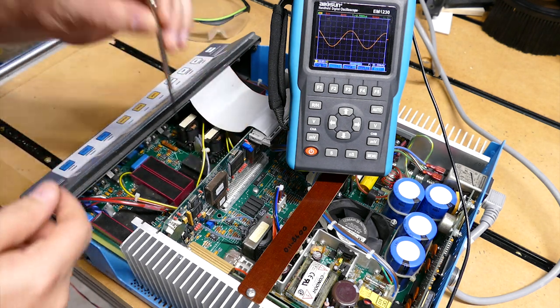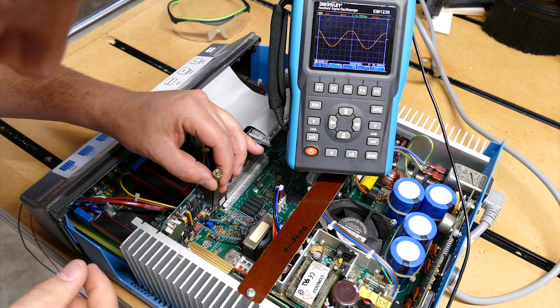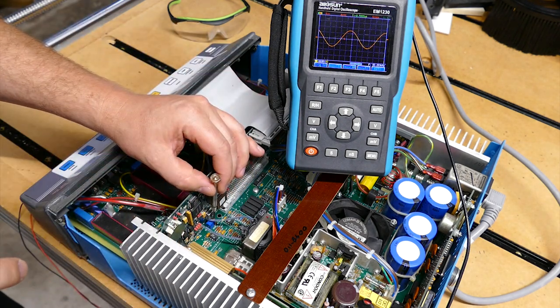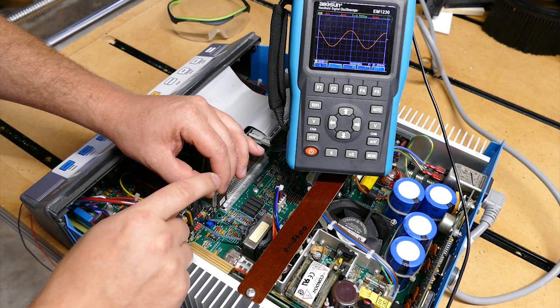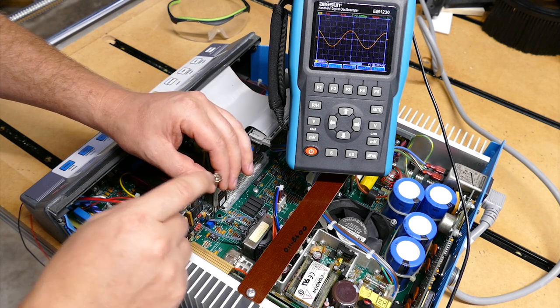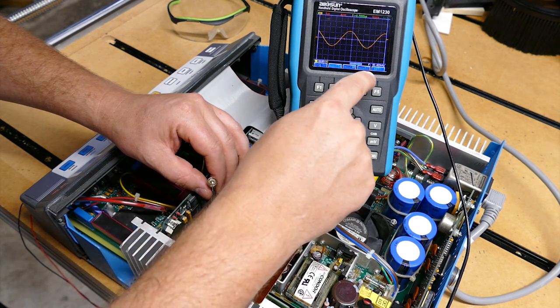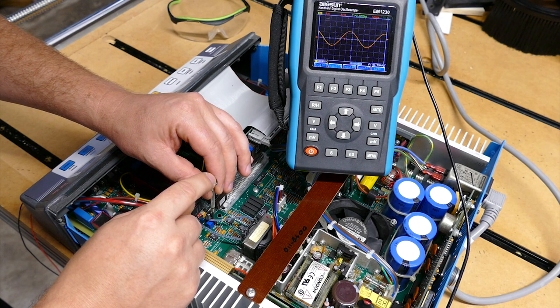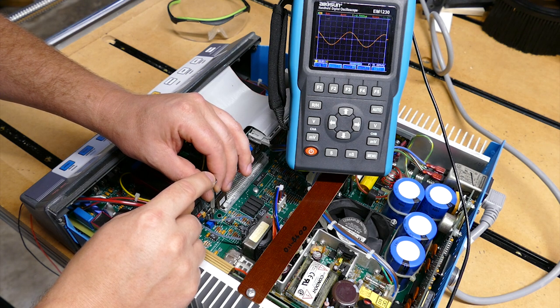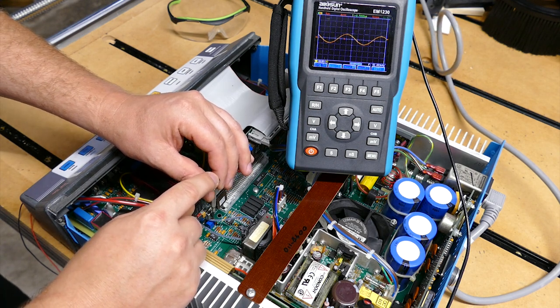So in order to do that, we are currently in OP mode. I'm going to stick my flathead screwdriver down on it. Be careful not to put any pressure down on the screw, because putting pressure down on a potentiometer will change the value to a superficial level. So I'm currently on the screw, barely pressing down at all, and I'm gonna rotate that potentiometer. It's currently at 80.626 kilohertz, and I'm gonna spin this potentiometer. And the waveform is actually going down, the amplitude of the wave. You can see that as the frequency goes up.